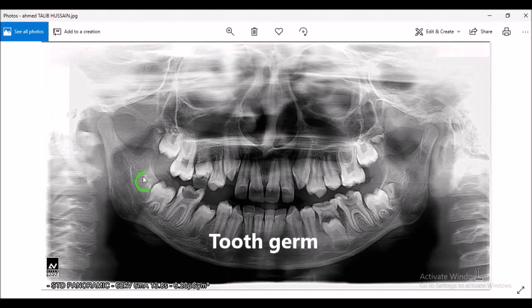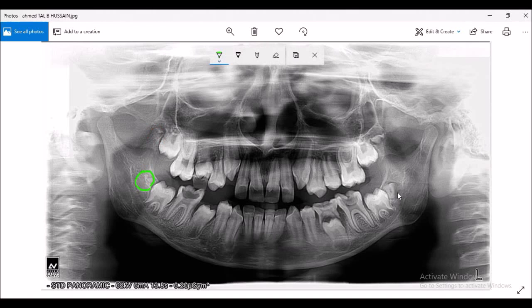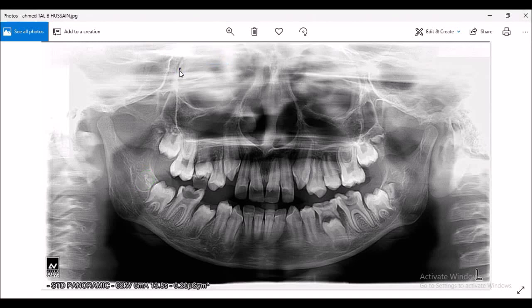So this is the condyle, this is the glenoid fossa also known as the mandibular fossa, and this raised portion is known as the articular eminence. This is the coronoid process. These are the developing tooth germs — more precisely, the developing tooth germs of the mandibular third molars, also known as the wisdom teeth.